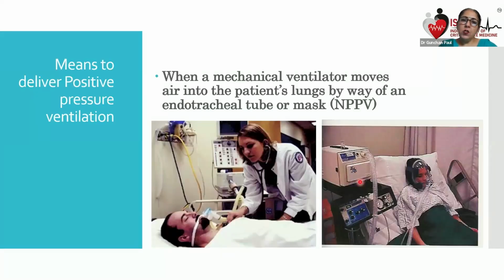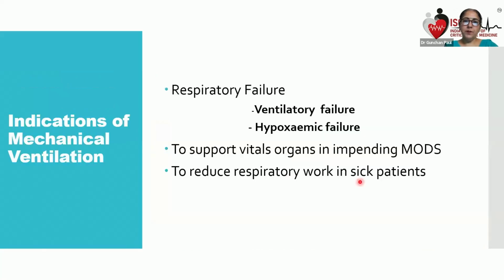That is very good. So when we are talking, if we give it through an NIV, apply a mask, it is non-invasive ventilation. But the NIV has problem of leaks, the problem of patient compliance. So if we want a more secure method of giving positive pressure ventilation, we put in an artificial airway or an endotracheal tube and we ventilate the patient.